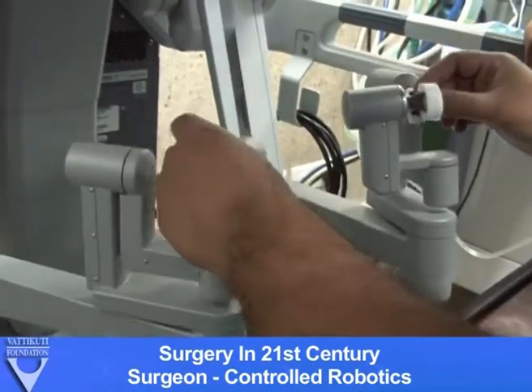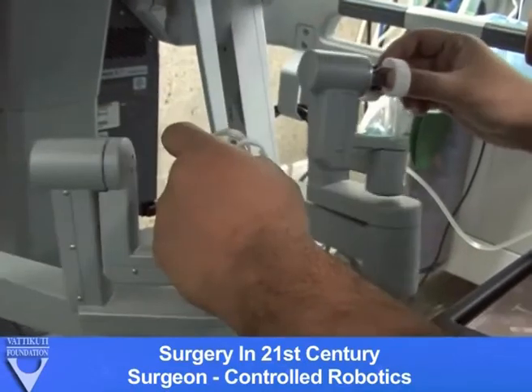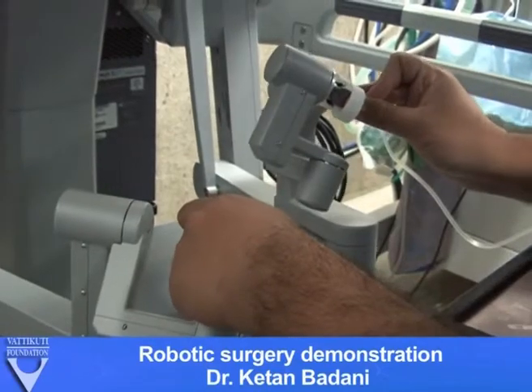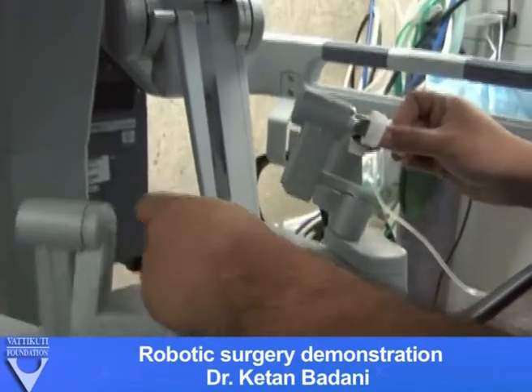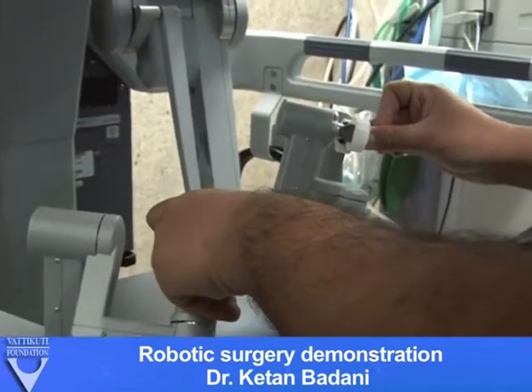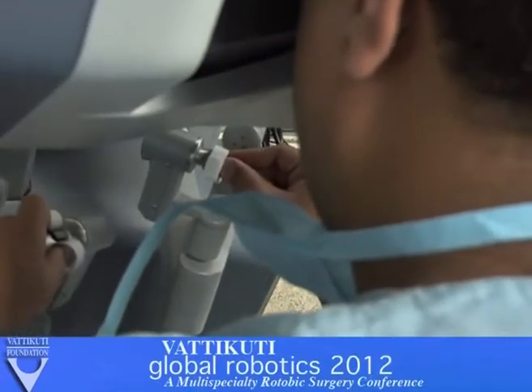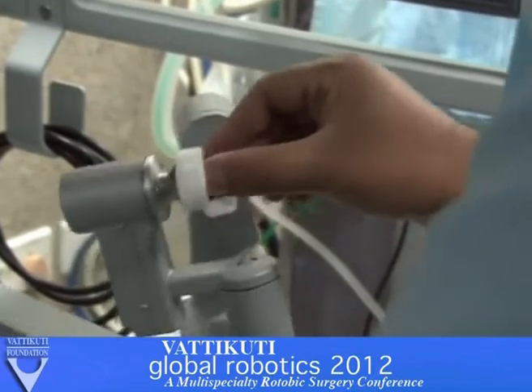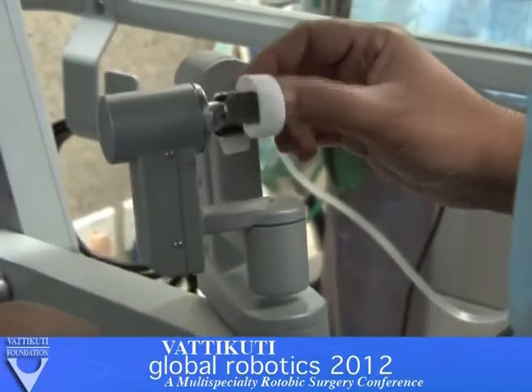So here we go. So we have our landmarks — spleen, there's our colon — so we'll drop all this. What's the monopolar level? Anybody? Do you know the monopolar level? What is it set at? 30. Okay, thank you.